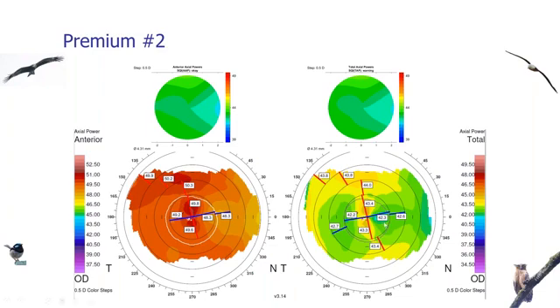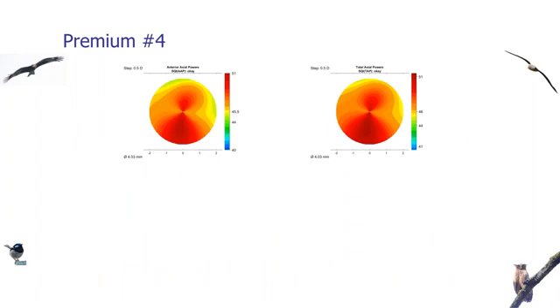This patient has had LASIK done, a myopic LASIK. It's not a very high correction. The corneal power is 42, a little bit on the flat side, not too flat. What is interesting is IOLMaster repeated measurements show the central corneal thickness is on the thin side. This is something that even a conventional corneal tomographer may have difficulty identifying as post-myopic LASIK with low myopic correction. You have to ask the patient. The other index of suspicion is the thin corneal pachymetry, which is available from IOLMaster 700. In this case, premium IOL or not? Like I said, I generally avoid premium IOLs.